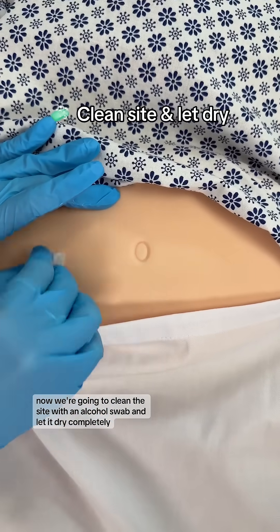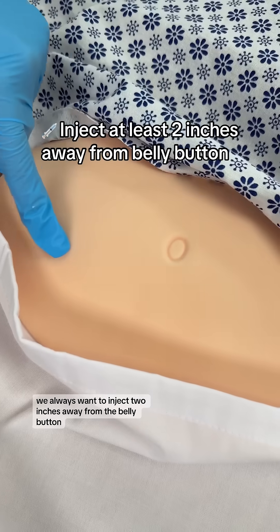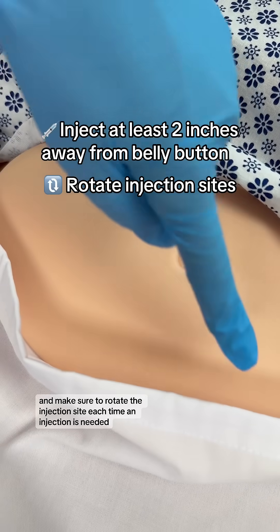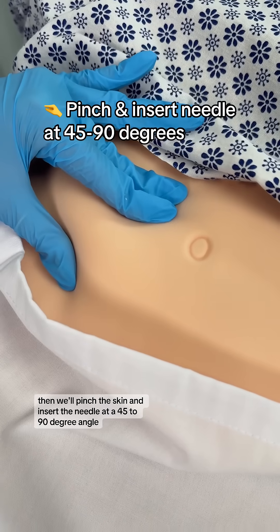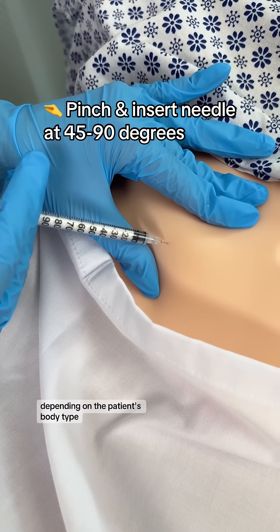Now we're going to clean the site with an alcohol swab and let it dry completely. We always want to inject two inches away from the belly button and make sure to rotate the injection site each time an injection is needed. Then we'll pinch the skin and insert the needle at a 45 to 90 degree angle depending on the patient's body type.